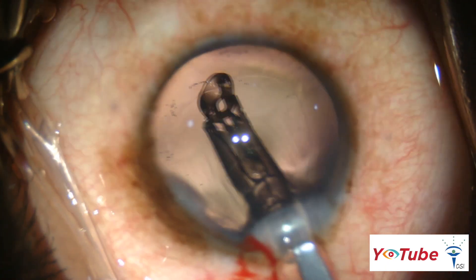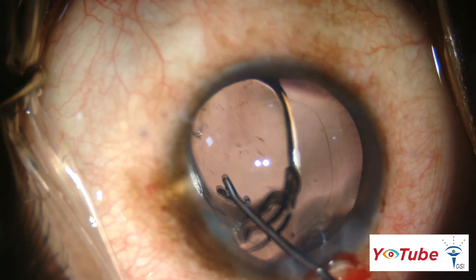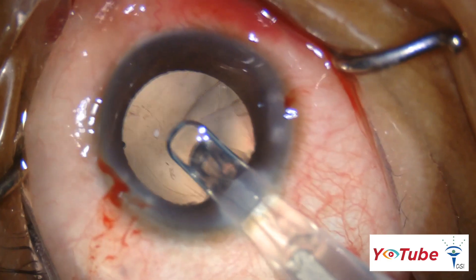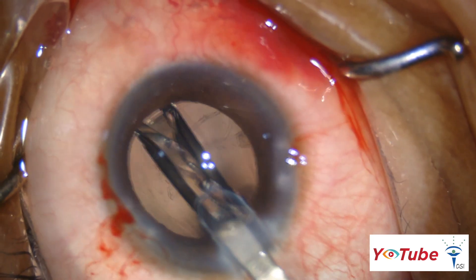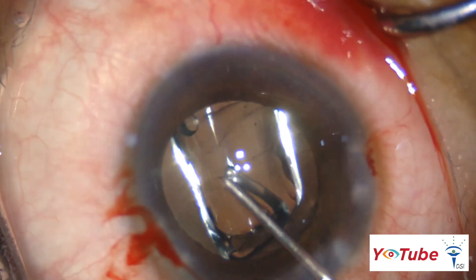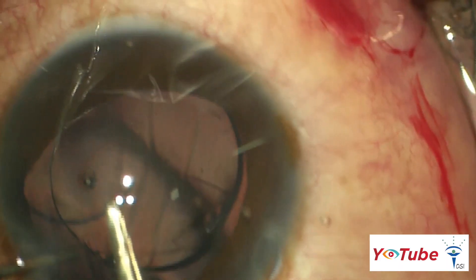The intraocular lens in an eye without a PC rent is carefully injected, taking care to avoid the posterior capsule during implantation. IOL implantation in eyes with a PC rent depends on the size of the rent. If the rent is small, it can be converted into a posterior capsulorrhexis and a foldable IOL can be implanted in the bag. In case of a large rent, a sulcus-supported three-piece IOL is implanted, and an optic capture is done to stabilize the IOL and reduce contact of the optic with the iris.